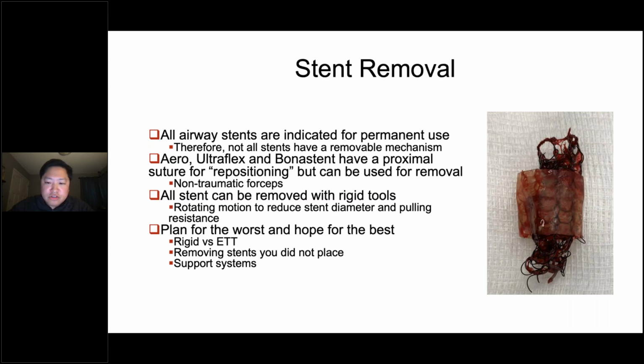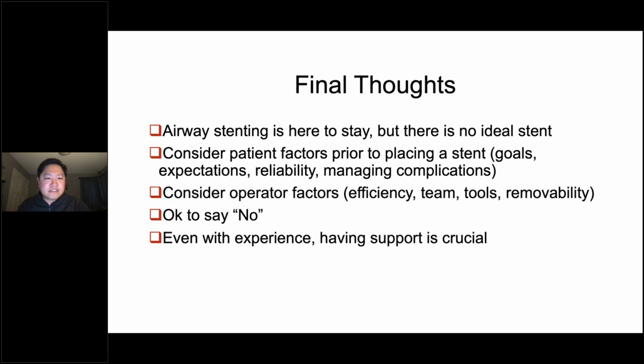And if you have a patient that you feel needs additional support, like ECMO or surgical support, make sure you have that lined up as well. So final thoughts. Just in my opinion, I think airway stenting is here to stay, but there's no ideal stent.